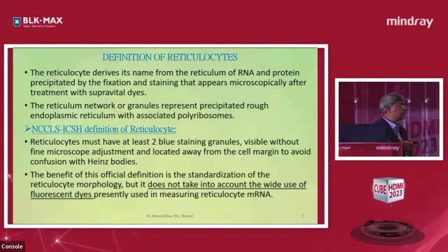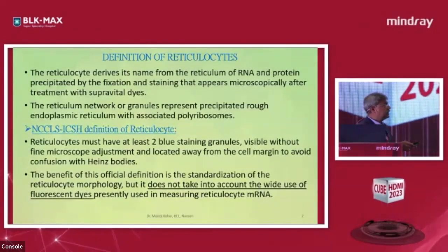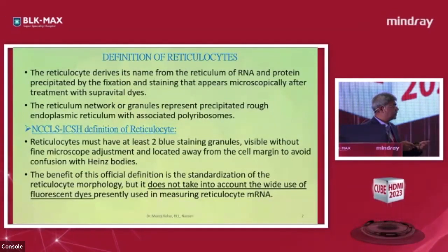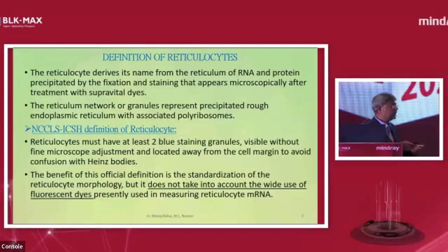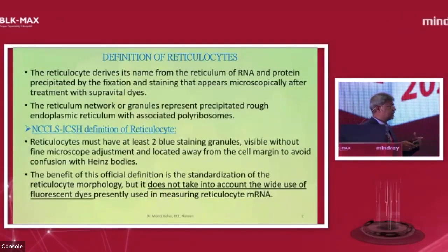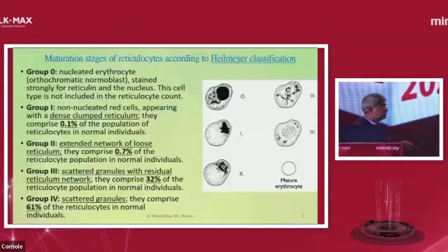The benefit of this official definition is the standardization of the reticulocyte morphology, but this definition does not take into account the wide use of fluorescent dyes that we are using presently in measuring reticulocyte mRNA. So this definition is not addressing the fluorescent dye which we are using.